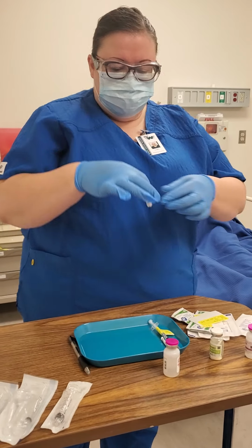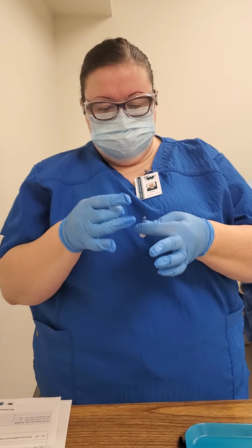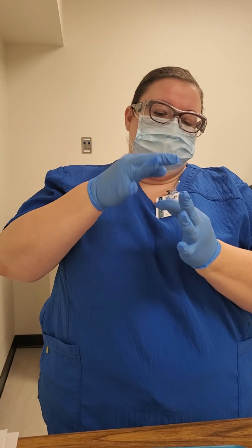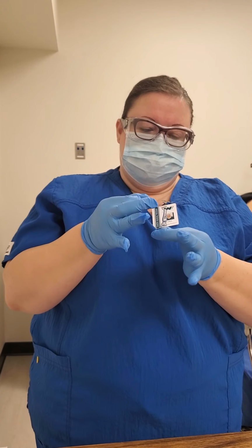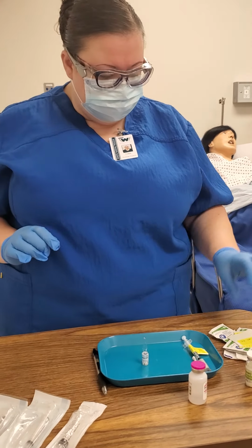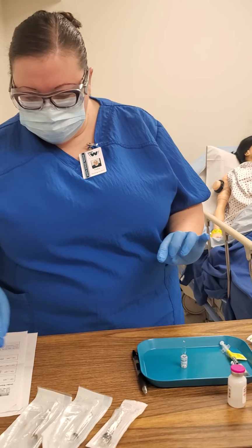And then for the second one, I'm going to do Phenergan. I can't get it. It just wants to stick in the top here. All right, and then first I'm going to get my needle ready for that one.